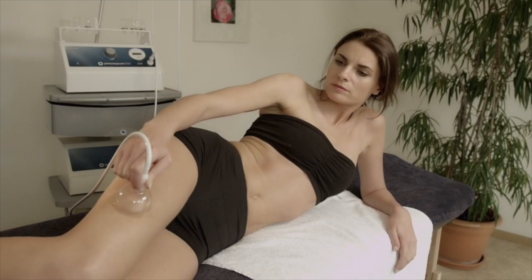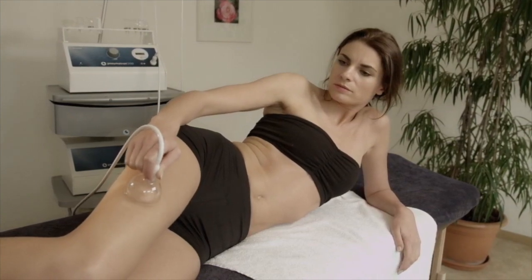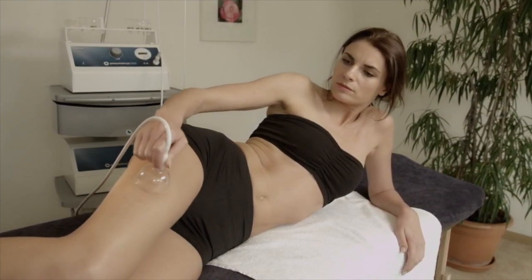For use on cellulite, depending on the objective, at least 6 to 10 weeks are needed, starting with 2 to 3 treatments per week. You can go ahead and increase the intervals between treatments a bit later. Please be sure to pay attention to the amount of fluids that are drunk. It is best to give your patient a glass of water before and after treatment.